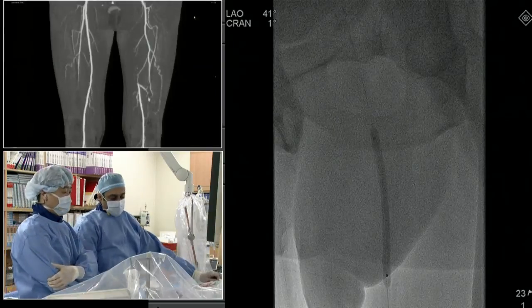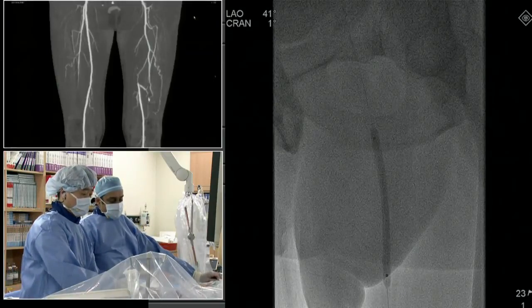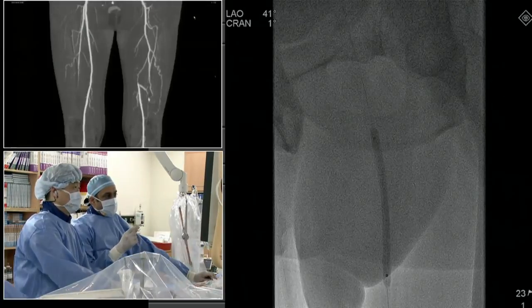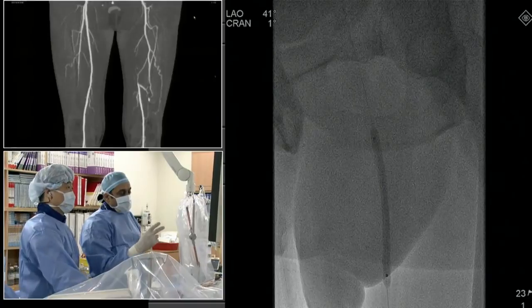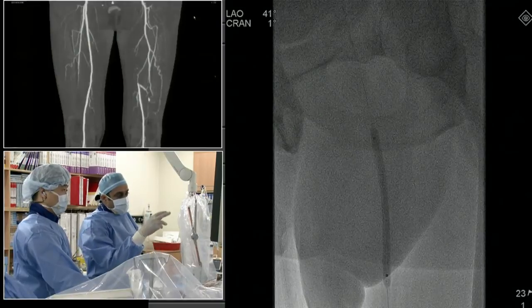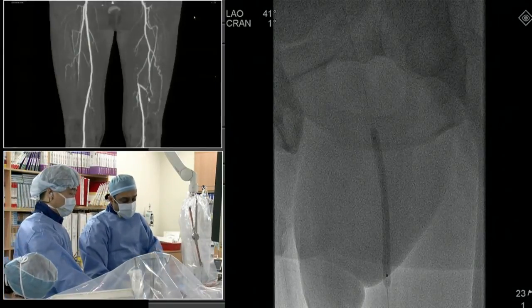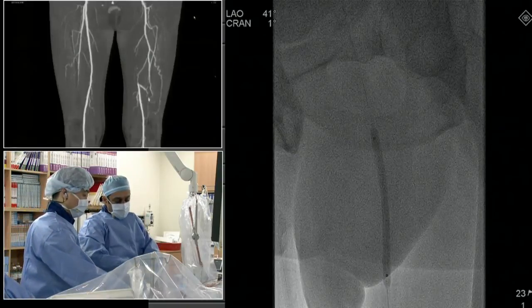You can skin this cat about a million different ways: proximal, mid, and distal, or just proximal and outflow, or just outflow alone. We used three balloons here, again very expensive. But there was still a little space left between the second and third one, so I just used the last balloon to go down a little further, potentially as a bare balloon or with minimal drug effect, to cover that area rather than go over the fourth.